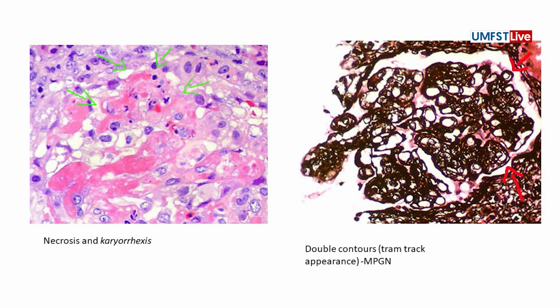And another finding for crescentic disease, an elementary finding, is necrosis. Usually it's not like a palisading necrosis in other cases. It's just fibrinoid necrosis because it's a capillary area, and we see some karyorrhexis.